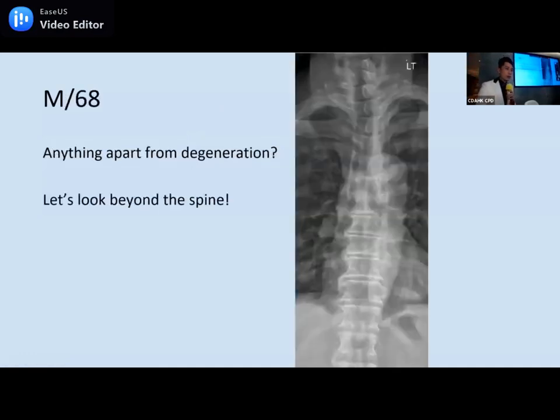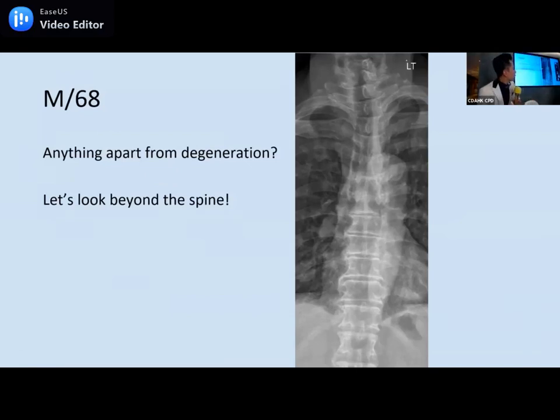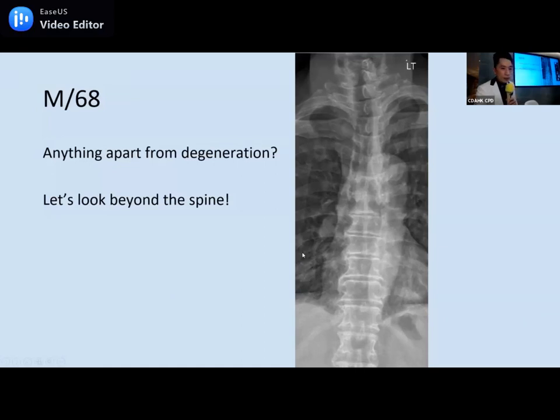Let's go to our second case: a 68-year-old man. On X-ray thoracic spine, if you look beyond the spine, there's a lung nodule in the right lower zone. What could that be?